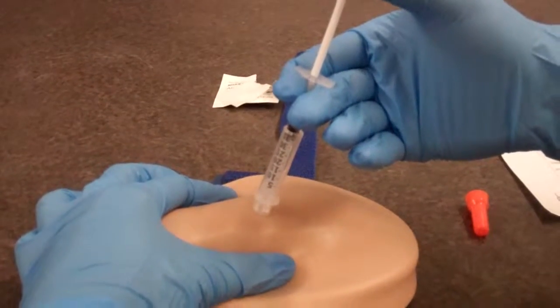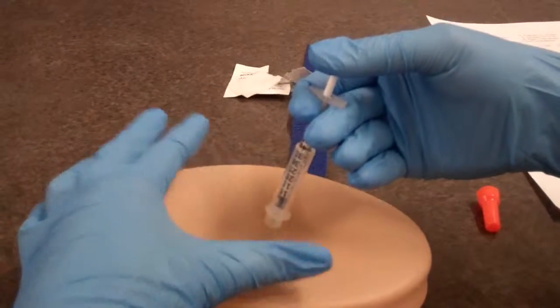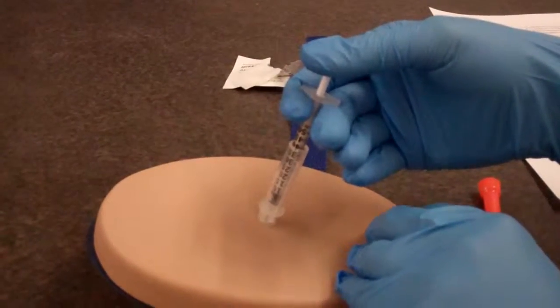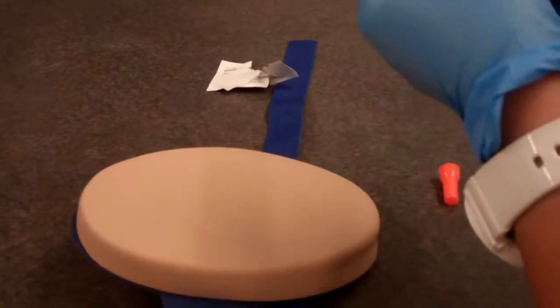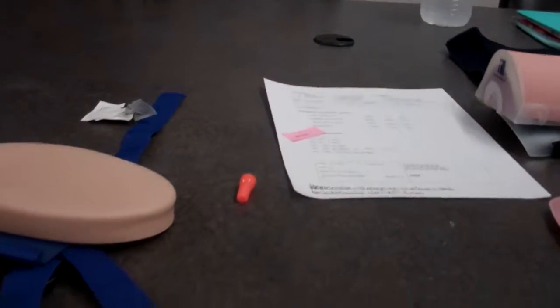And then withdraw the medication slowly. Release. Hold for 10 seconds. 1, 2, 10. I'm going to make sure the safety device is activated. Say sharps, sharps. Withdraw. Okay, how are you feeling? You feeling good? Okay.